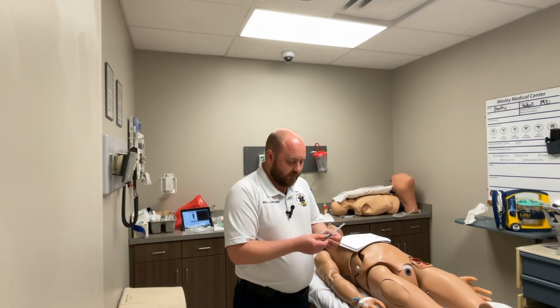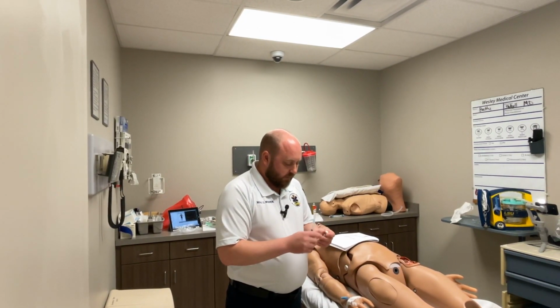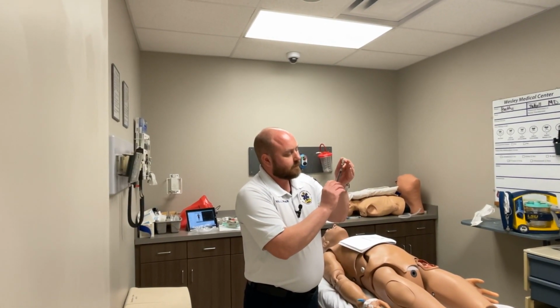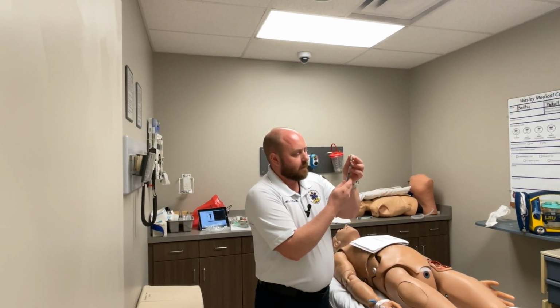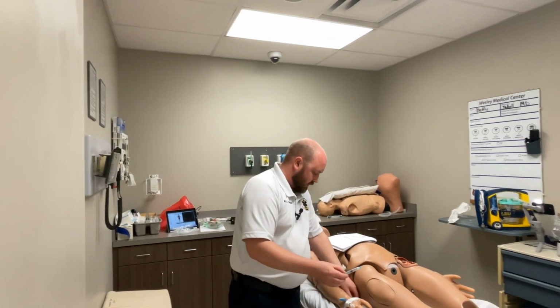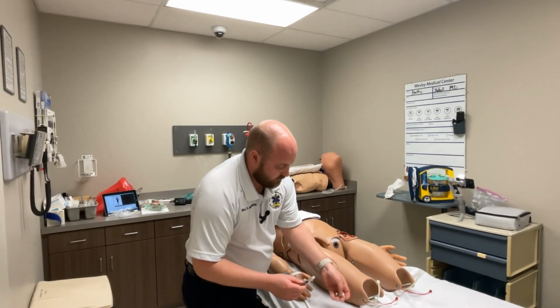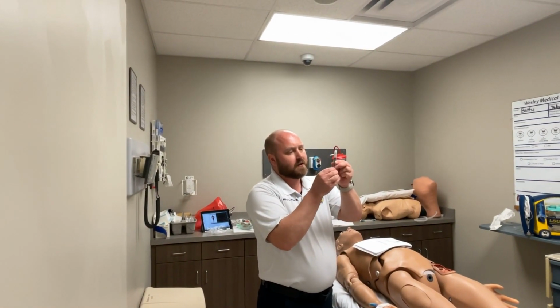So you've got to do a little med math. You've got to write it down. That's fine. We'll go ahead and wipe the top of your vial after you pop the cap. Inject your air, and then draw up your 1.5 mLs. You're going to put your needle in a sharps container. Okay, we're going to zero this out and make sure that we don't have any bubbles in the syringe.